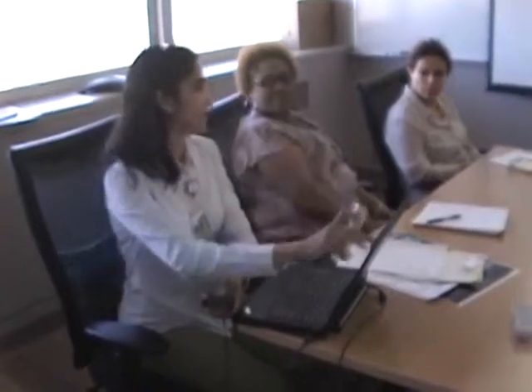So in order to do the barcode scanning, we need the scanner, and this is the modem. But in production, you will see only this barcode, and it will be attached to the workstation or the computer you are going to use at the patient bedside. So you can scan this barcode. So that is the first step. So I'm going to scan the barcode on this modem, so that way my scanner will be connected to my laptop for now. So when you see this solid green light, that means your scanner is connected to your computer.